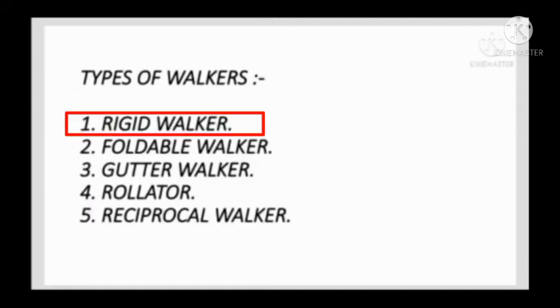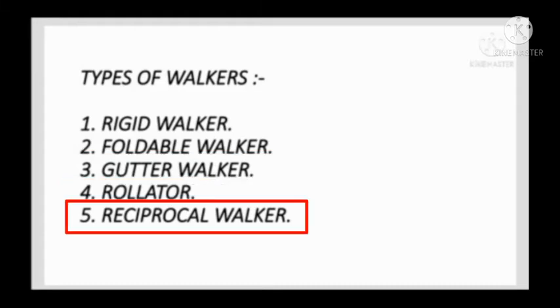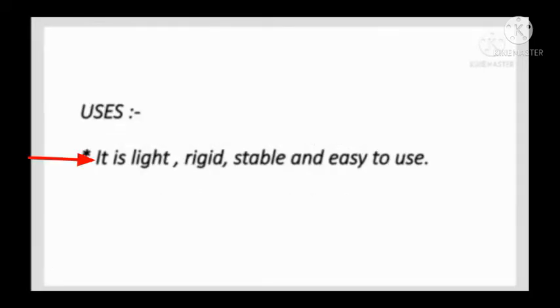Types of walker: rigid walker, foldable walker, gutter walker, rollator, reciprocal walker. Rigid walker: it is also known as the standard walking frame. It consists of four aluminum alloy vertical tubes which are arranged in a rectangle and are joined together on three sides by upper and lower horizontal tubes. One side of the rectangle is kept open. The lower ends of the vertical tubes are fitted with rubber tips. The ends are adjustable by means of a spring. Hand grips are fitted on the shorter upper horizontal tubes on each side. Uses: it is light, rigid, stable and easy to use.